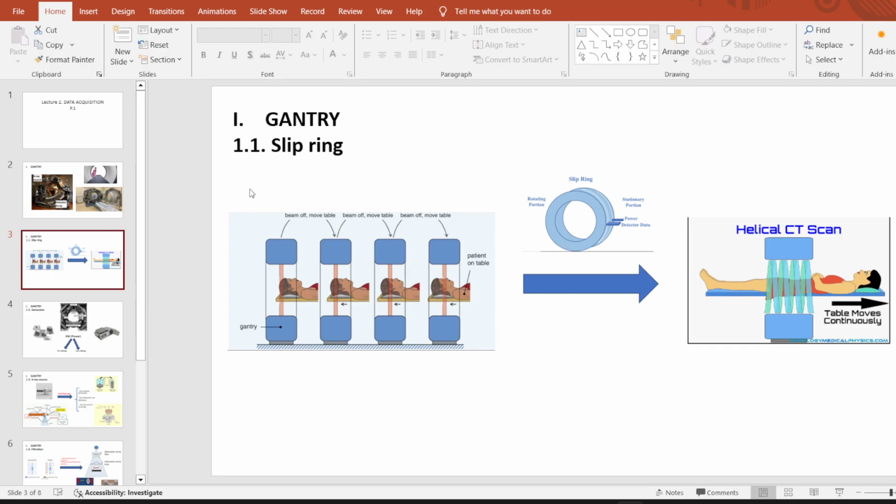Right now, we just need a slip ring, and they are two separate parts, no cables at all. That's the reason why our tube in the gantry can rotate forever in one direction without going back. Without going back, my friend.